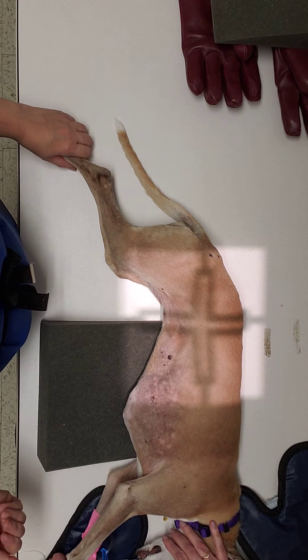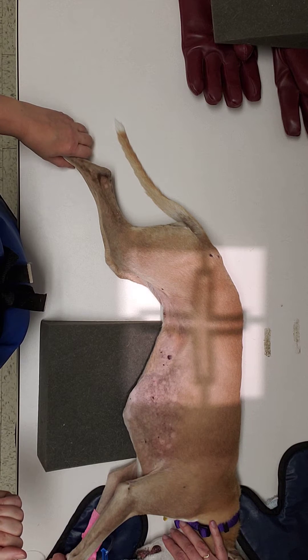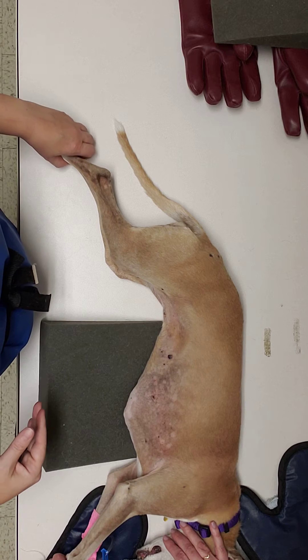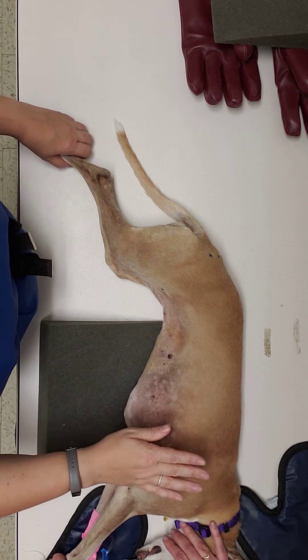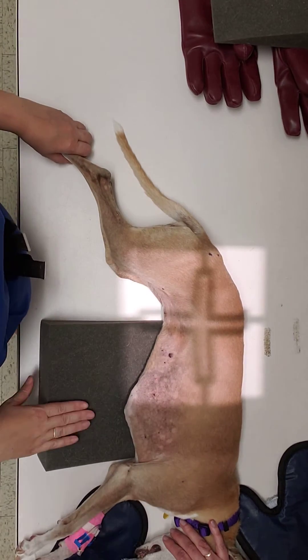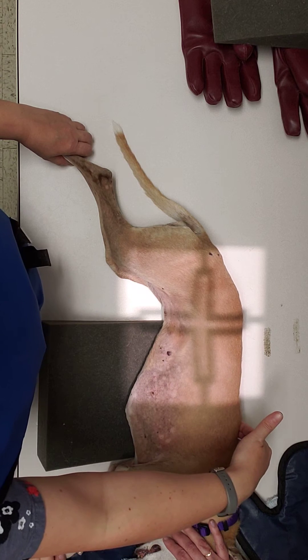We're going to talk a little bit about how to position and collimate for your lateral abdomen radiograph. Just like with the thorax, right or left is going to be determined by your veterinarian. They may want both, one or the other. We're going to place our patient in lateral recumbency and use our positioning devices to keep our sternum level with our spine.